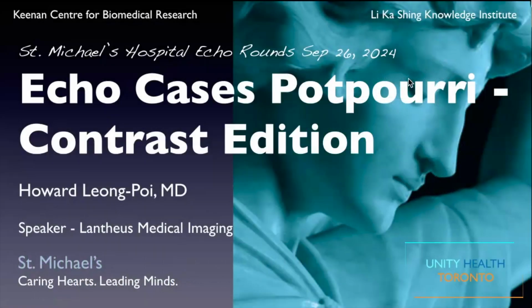Okay, all right. So today we're going to present the second edition of the Echo Cases Potpourri. The first one that I did was probably about a year ago. Actually, it was May of 23. But this is the contrast edition. So they're all contrast cases. You guys know I like contrast, right?